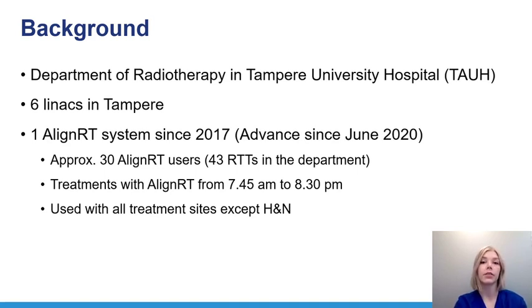We also have another surface-guided radiation therapy system, Catalyst, on the other TrueBeam, and RPM or RGSC are in use for DIBH treatments with the other 4 Linacs and 2 CTs. We use visual coaching for all DIBH CT scans and treatments. We've been using AlignRT since the beginning of the year 2017.